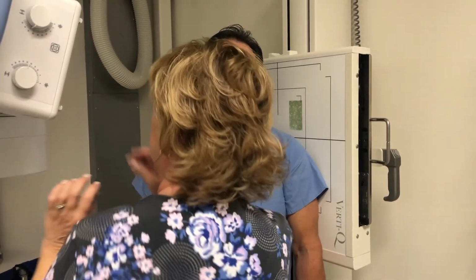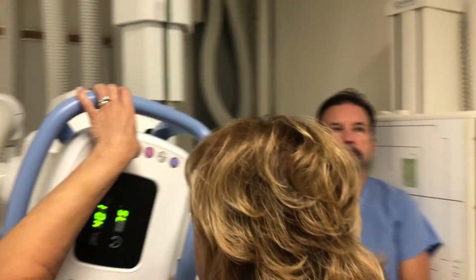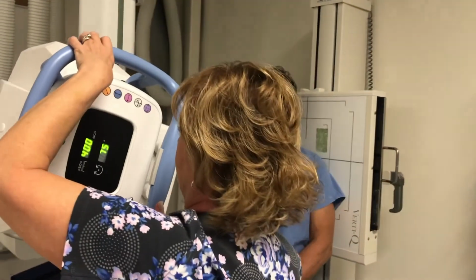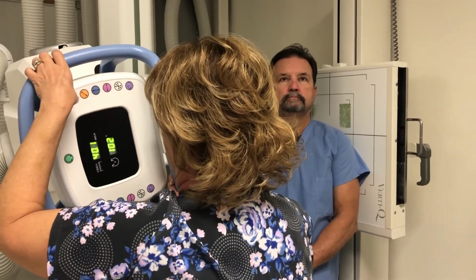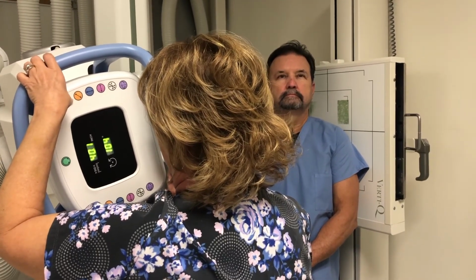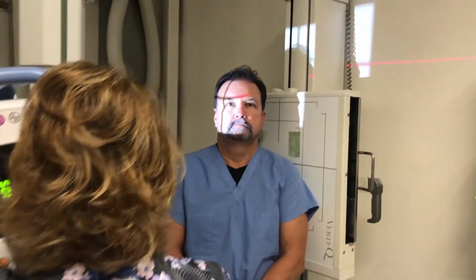I'm going to move the right marker over here and I'm going to change the degree of my angulation from caudad to cephalad. 90 would be about 105 because we're going 15 degrees beyond 90.